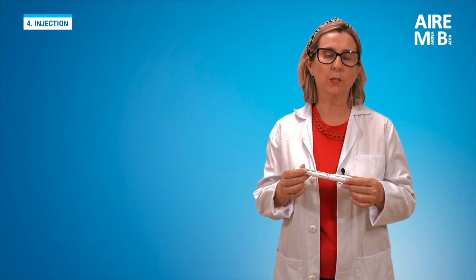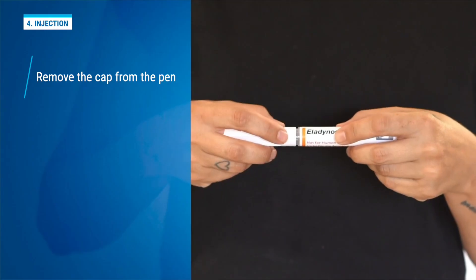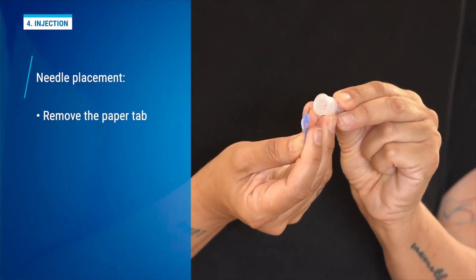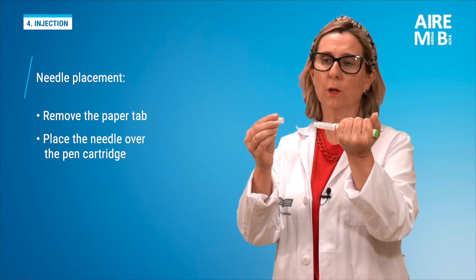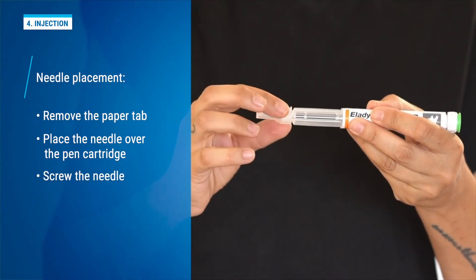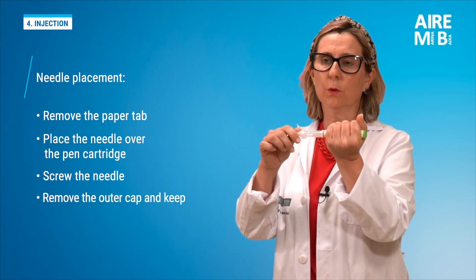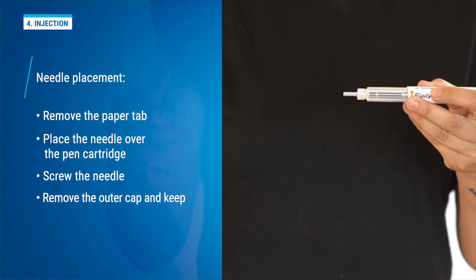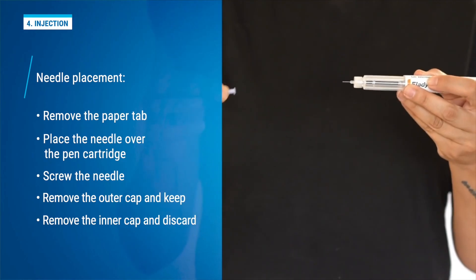Now we prepare for the injection. We carefully remove the cap from the pen by pulling it off. We gently remove the paper tab. We place the needle by pressing it onto the cartridge of the pen and screw it on until securely fixed, without tightening too much. We remove the outer cap of the needle and keep it — we will need it later. We remove the inner cap of the needle and dispose of it.